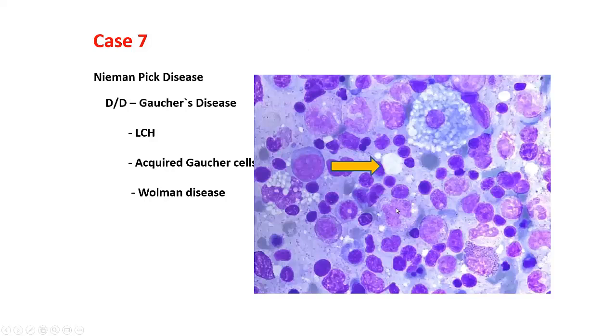So let's see, this is the same picture. Here, this is what the picture was. Foamy cytoplasm, you find this vacuolated cytoplasm. Now, this is typical of Niemann-Pick cells. This is another Niemann-Pick cell, but this is a typical small nucleus, large macrophage, showing you these vacuolated cytoplasm.